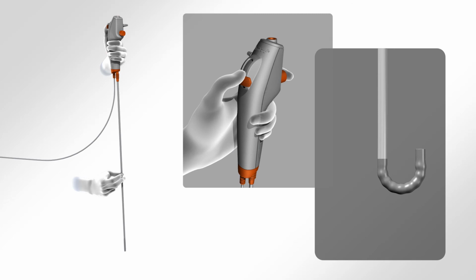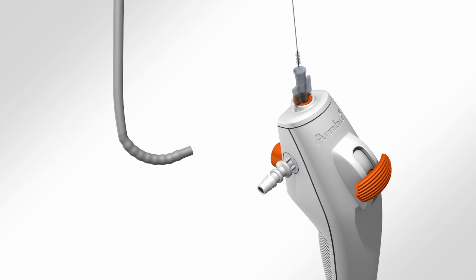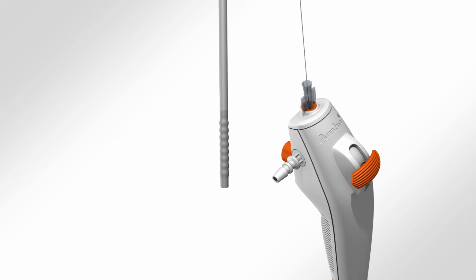Carefully slide the control lever forward to confirm that the bending section functions smoothly and correctly. Verify, if required, that endoscopic accessories of appropriate size can be passed through the working channel without resistance.